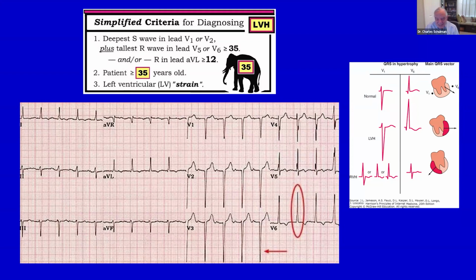Ann is pointing out that machine readings are often variable, and they'll have three different interpretations from three different sheets if the assistant takes several pages. Yes, it can do that, and I don't know the explanation for that. You'd think they'd all be exactly the same, but they sometimes are not. Unless you've moved an electrode or something like that.